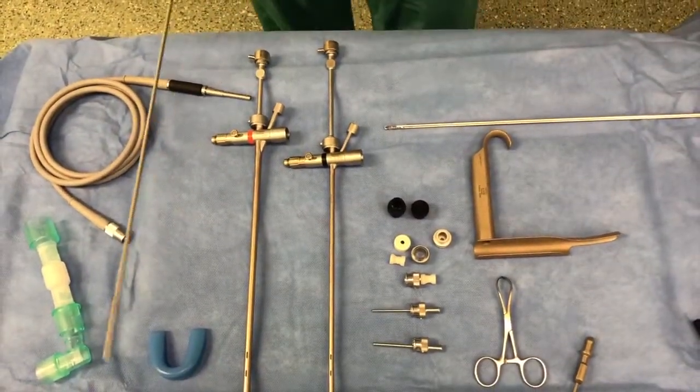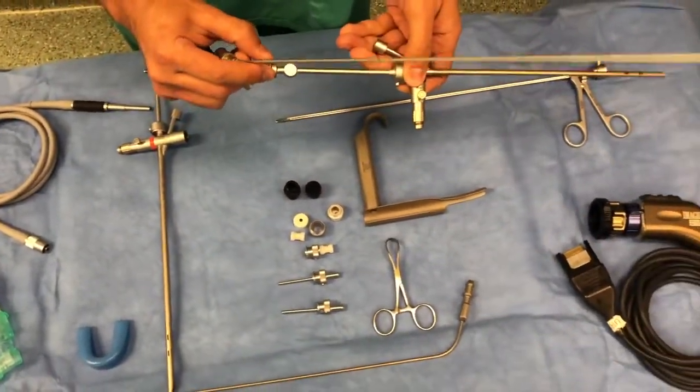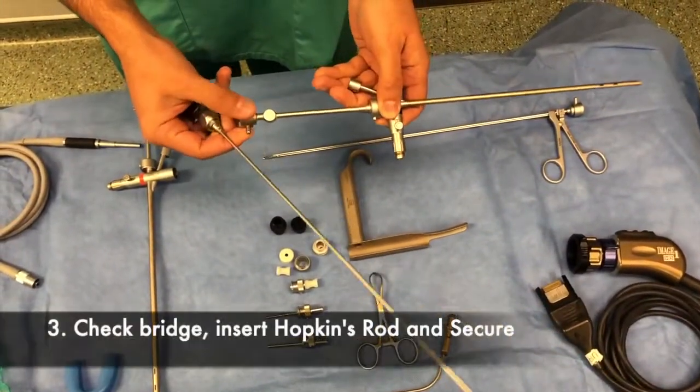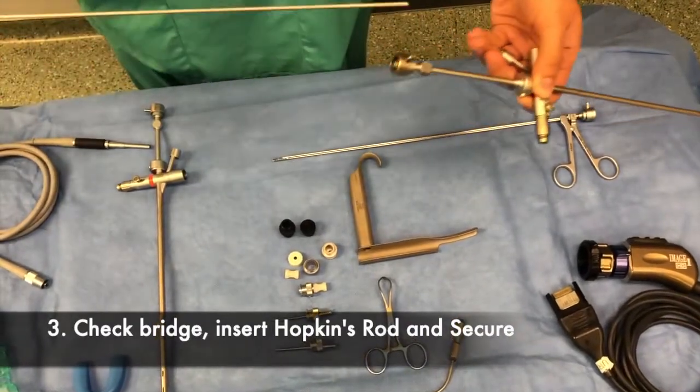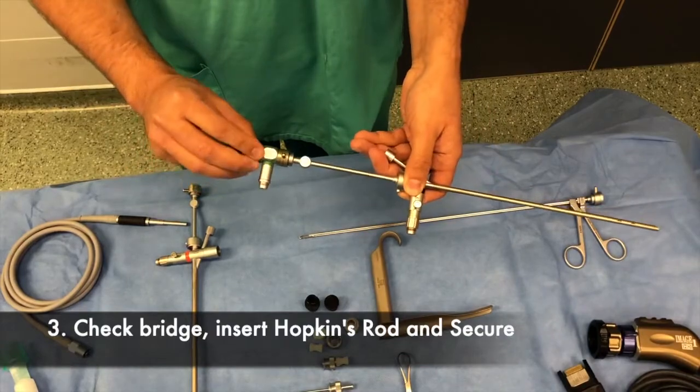Next, the Hopkins rod is inserted into the bronchoscope. First, the bridge is checked, the ends are aligned, and the endoscope is passed through and locked into place.